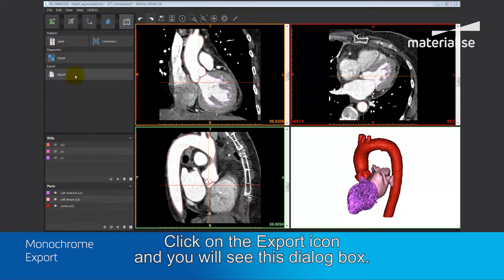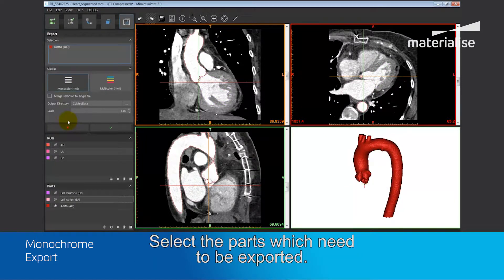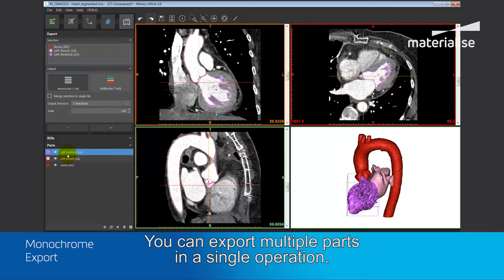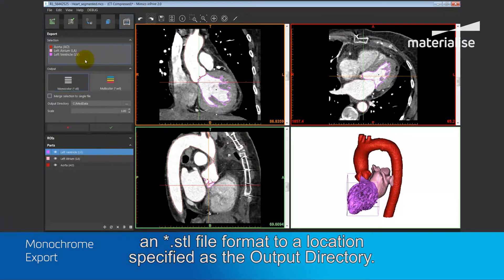Click on the export icon and you will see this dialog box. Select the parts which need to be exported. You can export multiple parts in a single operation. Once you select OK, the green tick icon, the parts will be exported in an STL file format to a location specified as the output directory.